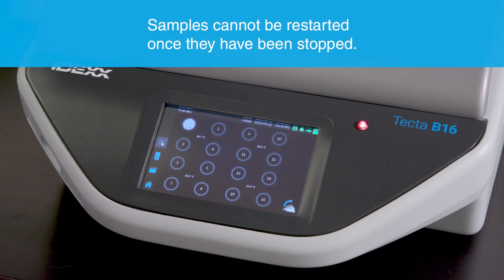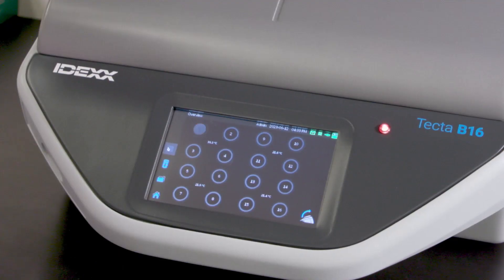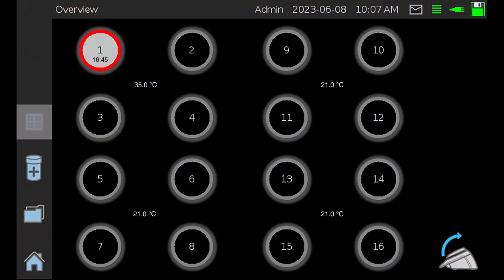The test will remain in process until either the target bacteria are detected or the test completes without detecting the target. The time to a negative result will depend on the test cartridge being used. In this example, the TECTAlert ECTC test has a test time of 18 hours for negative results. If a positive is detected, the chamber will show a red icon. It is not necessary to leave positive samples in the instrument after the red icon appears.